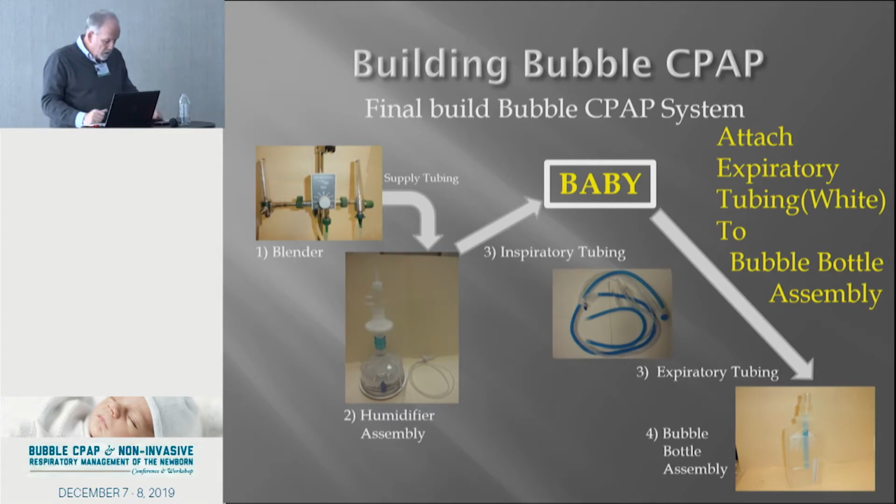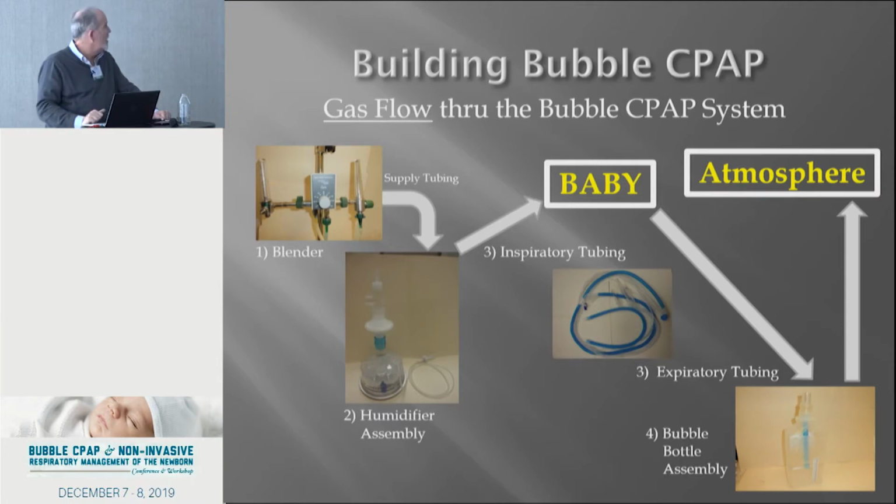So, if you believe, and I'd love somebody to prove it, in the oscillator effect of those bubble releases, because if you put your hand on the expiratory limb, you can feel each bubble release. You can feel that, or if you turn the flow up, it changes, okay? It is easier on smaller babies because they don't have as large an inspiratory volume. Okay, and then you need to let it get to the atmosphere in some way, okay? Whether it's a hole, which isn't as elegant as the top, but anyway.